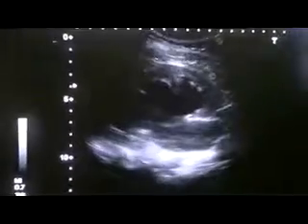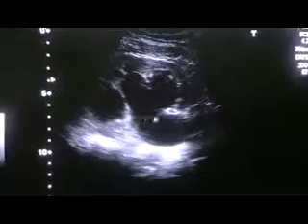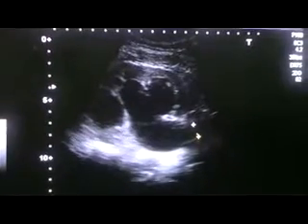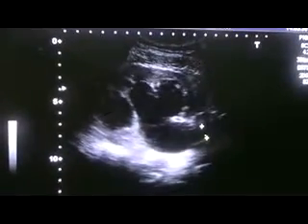Now this is the left kidney, and you can see that again the same findings as we saw on the right side are being seen on the left side, and there is dilation of the proximal ureter, but here the proximal ureter is dilated much more as compared to the right kidney that we saw. Now in front of you is the left kidney with these dilated calyces, pelvis, and this tube-like structure is the proximal ureter that measures 12.5 mm, so this is dilated more as compared to the right kidney.